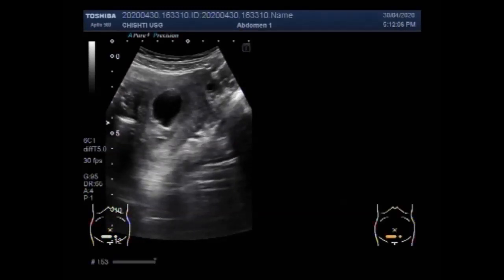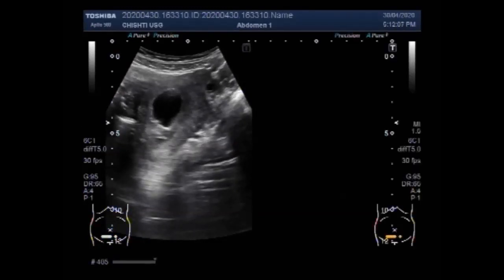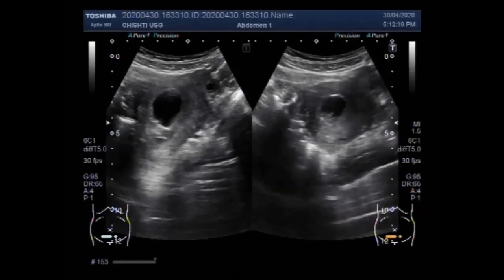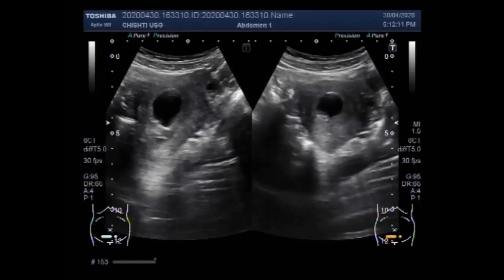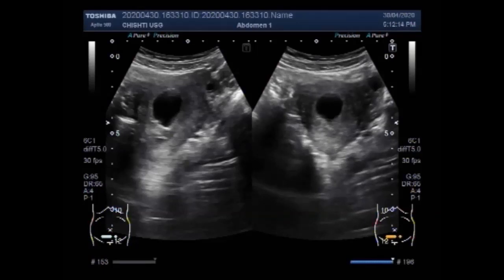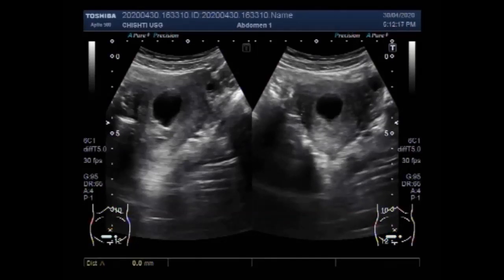You can see the gestational sac having no product of conception. In addition, between five and a half to six and a half weeks, a fetal pole or even a fetal heartbeat may be detected by ultrasound, especially vaginal ultrasound.